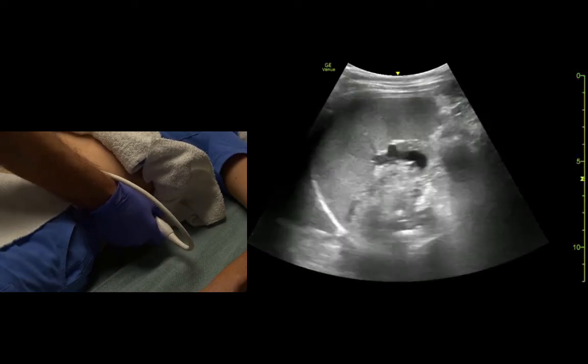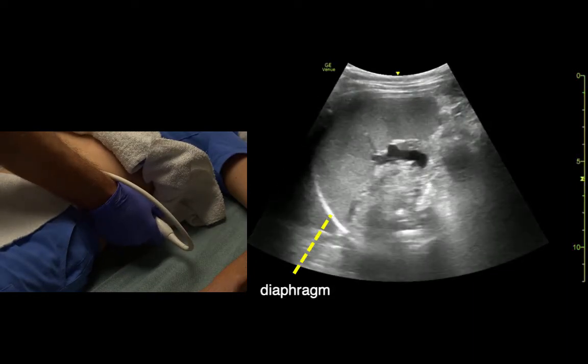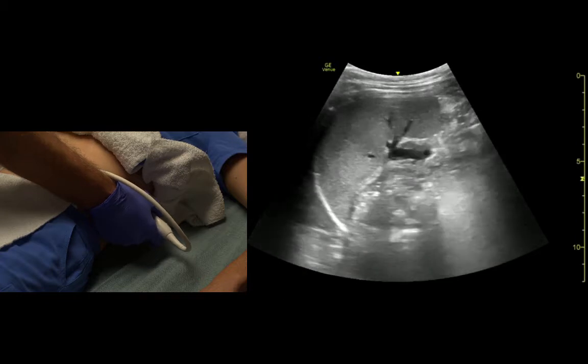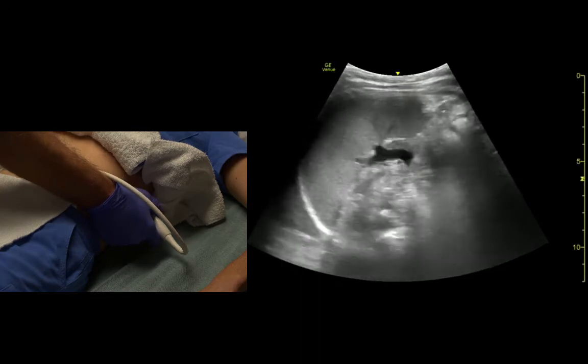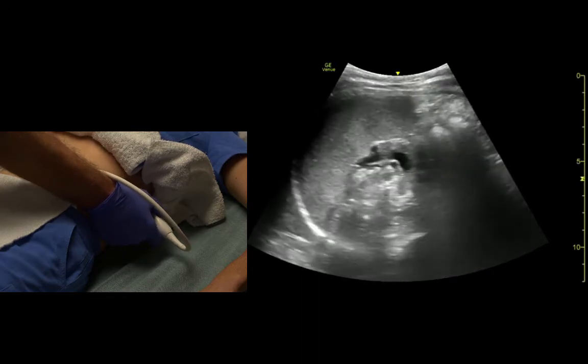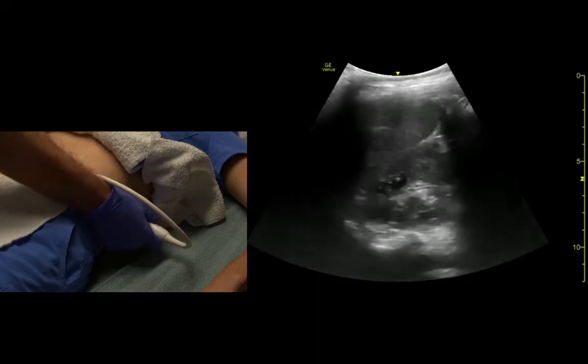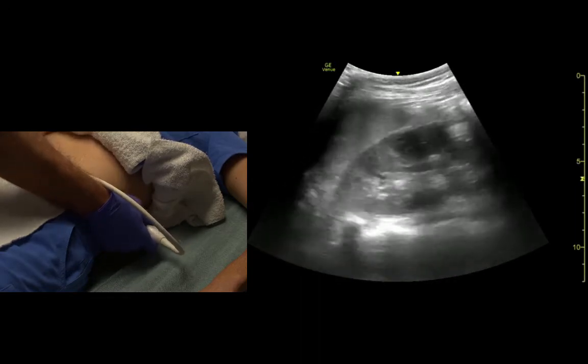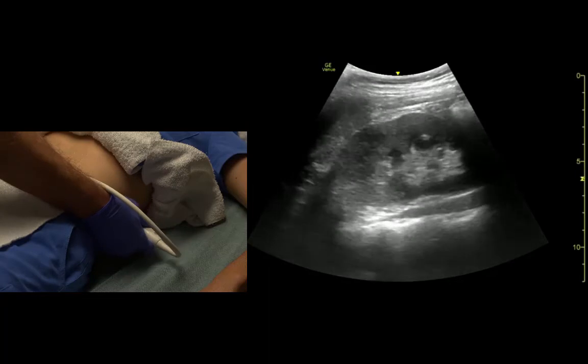And we can see the spleen underneath the diaphragm. If we fan posteriorly there, we see the kidney.